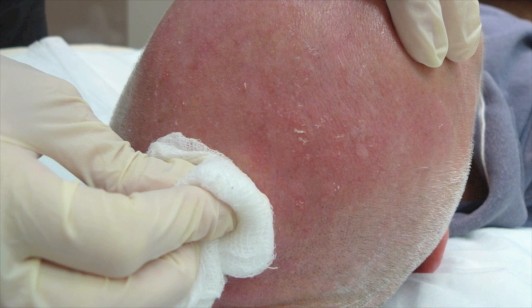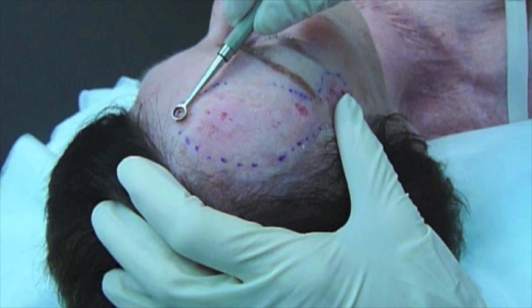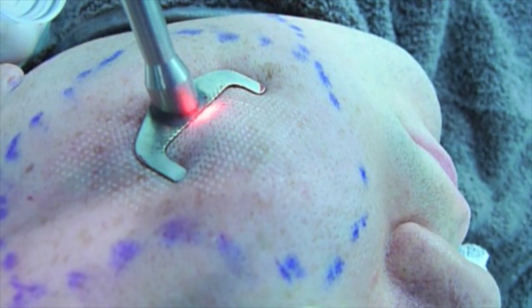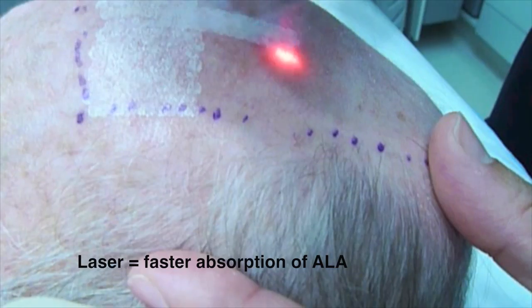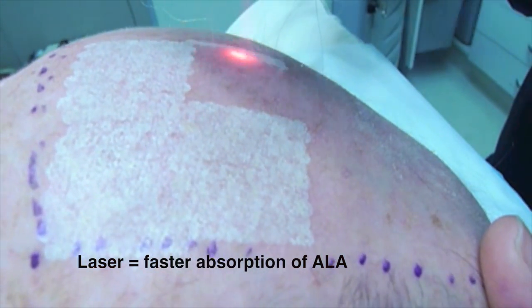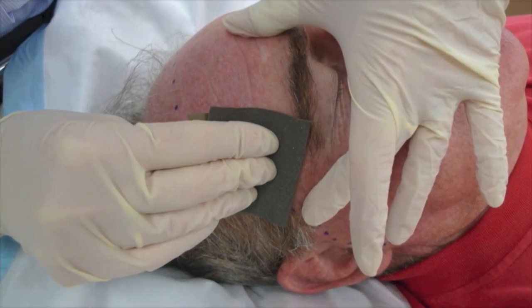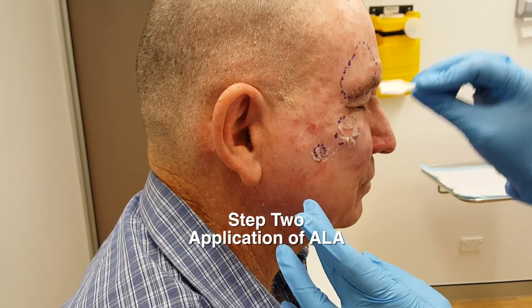We've prepped the area. There are various ways to prep it — we can use gauze, we can use a curette. Sometimes I even use a laser, which means faster absorption time for the cream. I can use either a fully ablative laser or fractional laser. But the best way I've found is sterilized sandpaper, believe it or not.